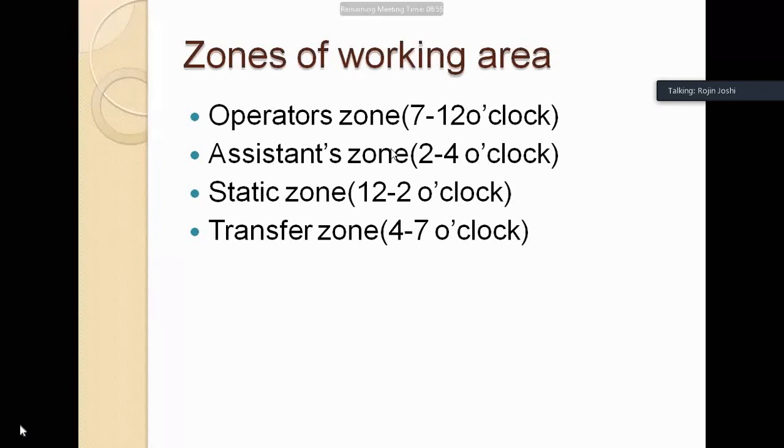So operator's zone is the zone in which the operator will always be working. That is from 7 to 12 o'clock. Okay, this is for a right-handed operator. For left-handed, it will be from 12 to 5 o'clock.